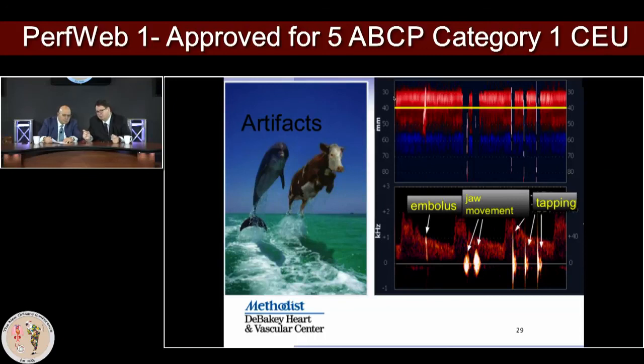While you're traveling that 3 centimeters, you definitely have like a forward slash kind of pattern that it takes time to get the 3 centimeters. And you can tell what is the speed, because the speed is here in red on the right side of the screen. So it says 40. Sorry, you see underneath the tapping words? Yes. And this is where you can see that this is the scale for the speed.